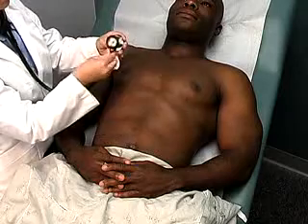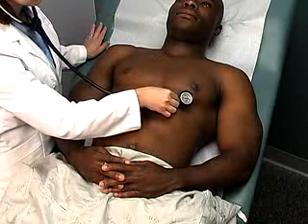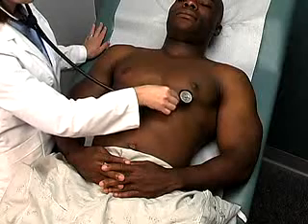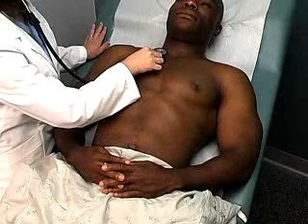Next, flip the head of your stethoscope to turn on the bell. Auscultate the mitral area with the bell. Auscultate the other areas with the bell if time permits. The bell may allow you to hear low sounds that are inaudible with the diaphragm.